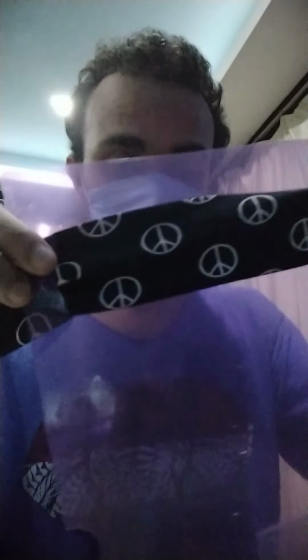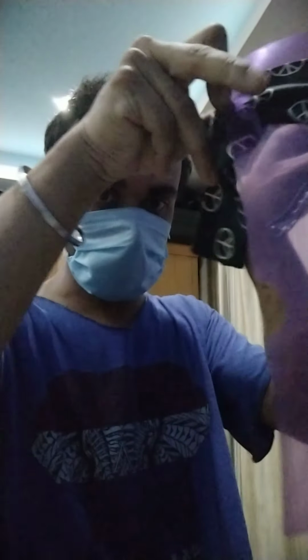So before wearing this, obviously I would recommend that you wear a mask, because this won't be enough to protect you against this. This is obviously an extra protection shield which can help you. So all you can do is, after this, if it's tied up, you can just wear it around your head like this.